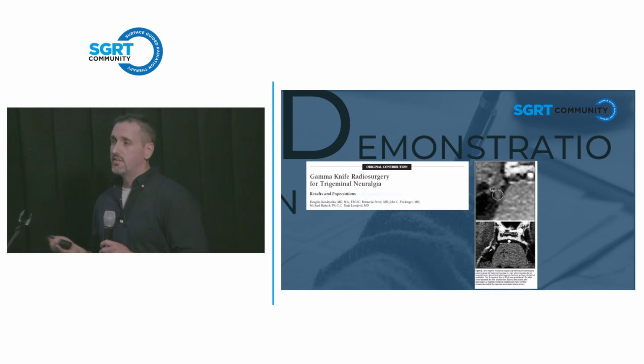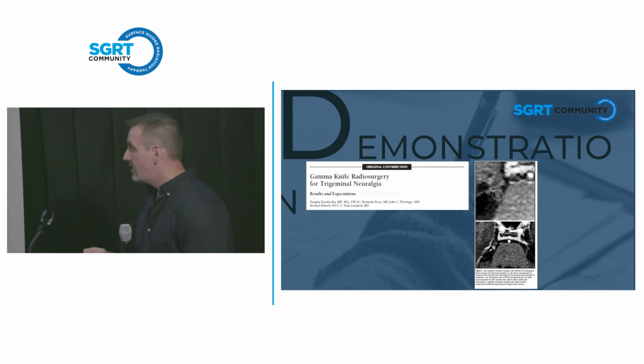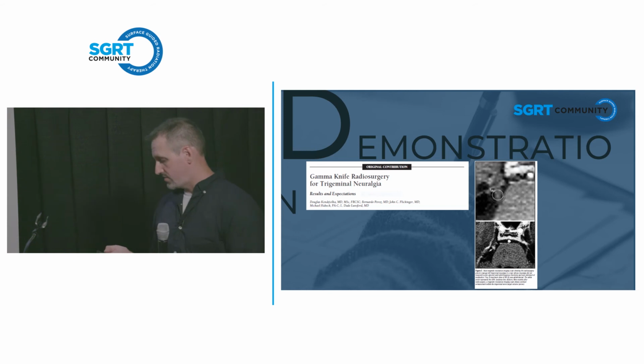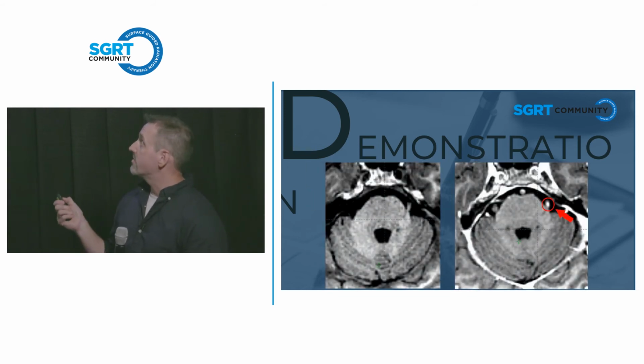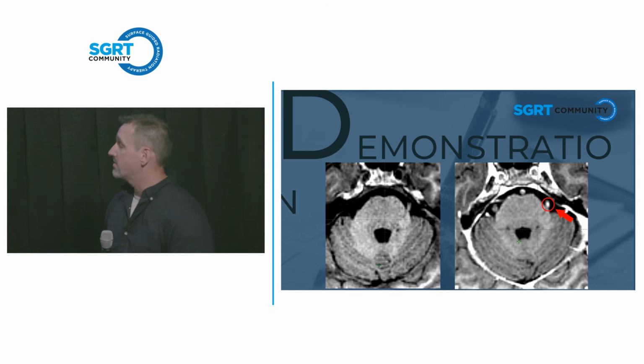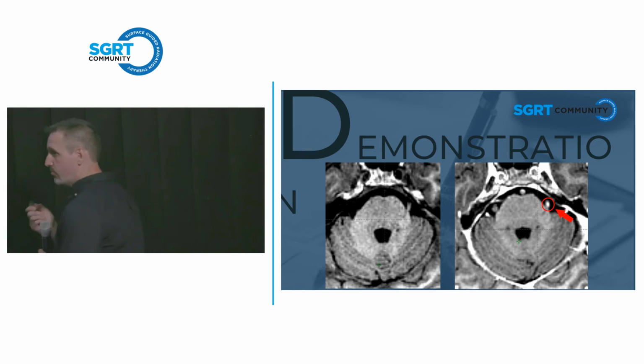So we thought, hey, we're doing this trigeminal neuralgia with SGRT. Are we doing the same thing? So this is one of our trigeminal neuralgia patients. Again, the nerve from the planning scan, and here's a follow-up scan that we are doing now, tracking some other radiological changes from other SRSs, and we can see the hyper-intense signal on that 4mm cone plan.